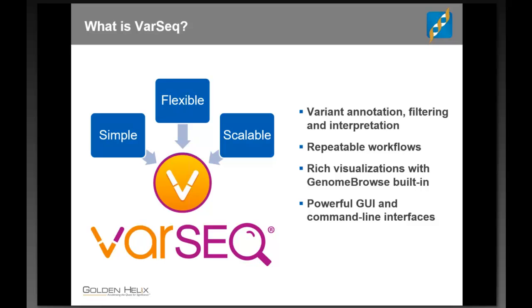And so again, around that user interface, it has to be simple from the perspective of, can I get all the information I need intuitively? Obviously, it needs to be flexible because every test is different. And that's sort of the process in which you configure all of those choices that are test specific. And it needs to scale because we'd want this to handle not just individual gene tests, multi-gene tests, large-scale, hundreds of gene panels, but up to exomes and genomes.